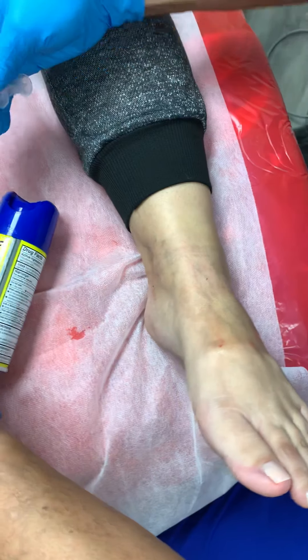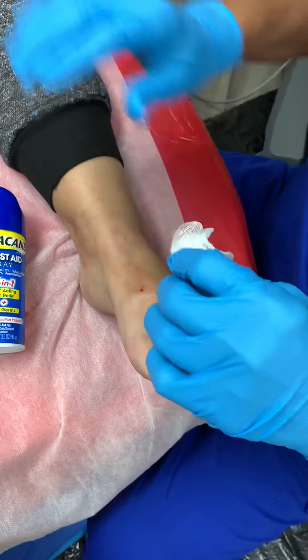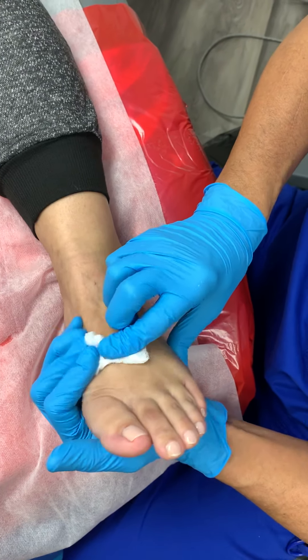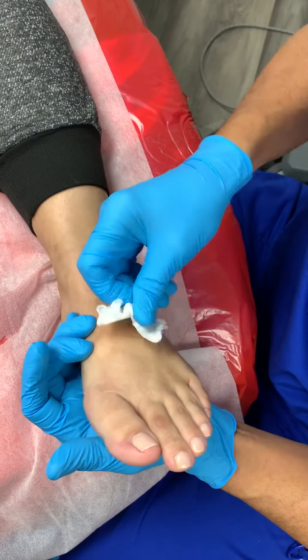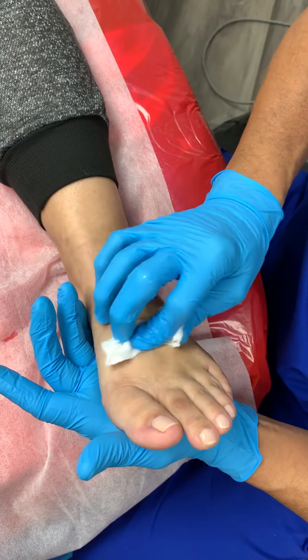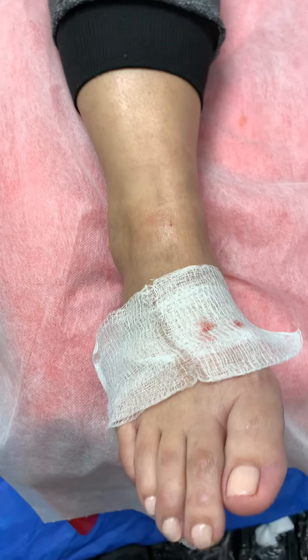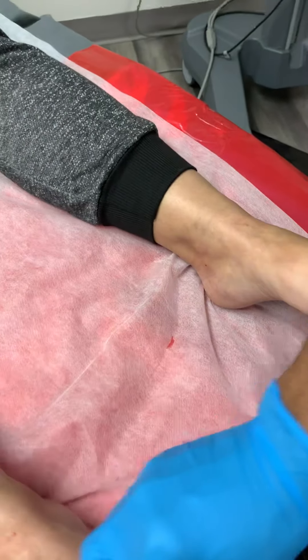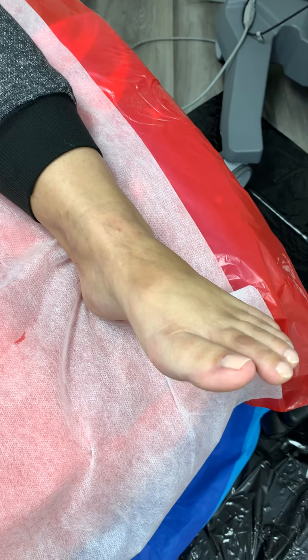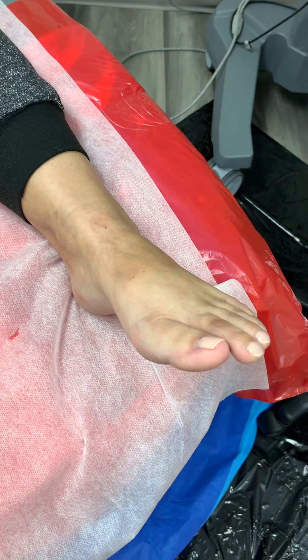This is what we call a total ankle block — numbing the entire foot and ankle. In a couple of minutes the patient will feel as if the foot is not attached to the lower leg — a very, very bizarre feeling. For all of our viewers always asking how we numb the foot, the ankle, the toes — what we did here was a total ankle block. The whole foot, top and bottom, the entire foot and ankle will be numb.